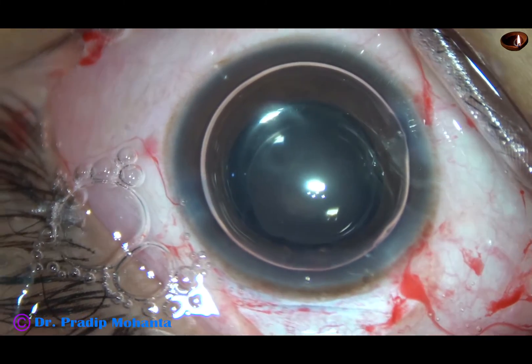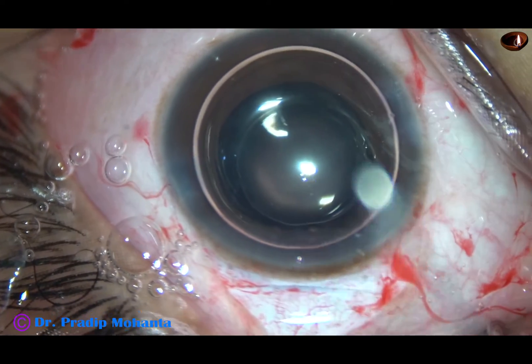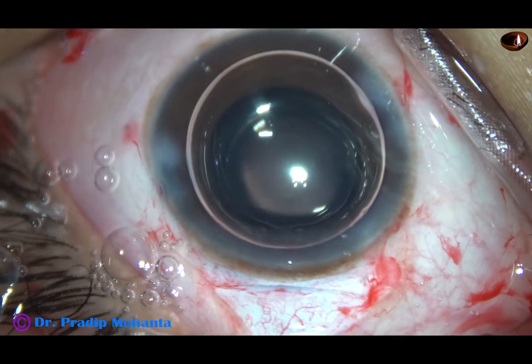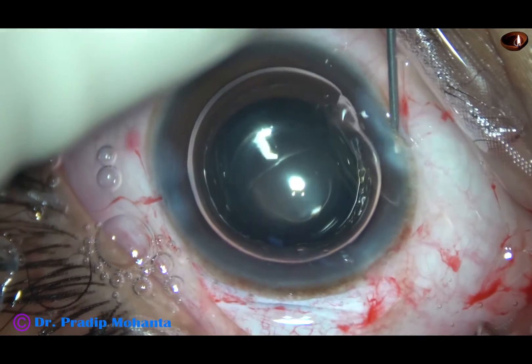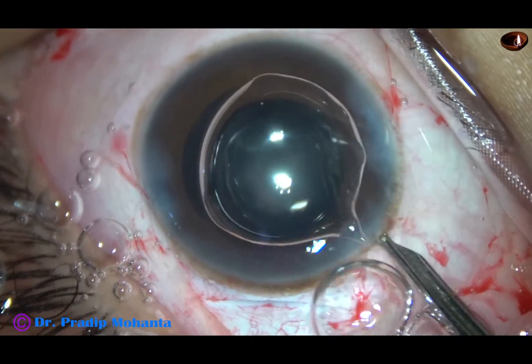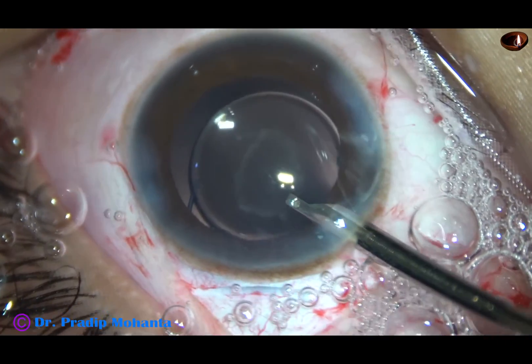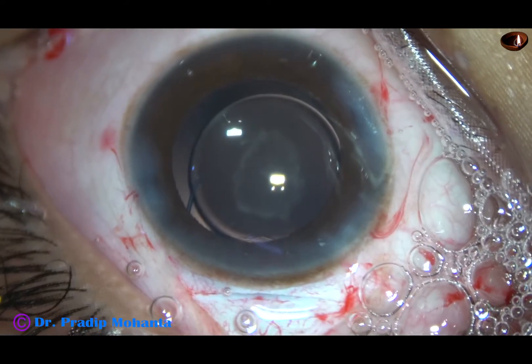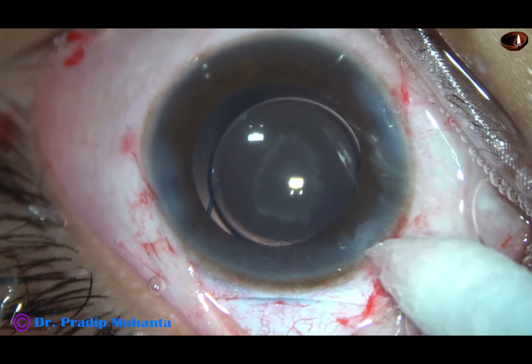To maintain the anterior chamber, I inject an air bubble. Here goes the moxifloxacin. And now I hydrate the corneal stroma on either side of the side ports for closure of these stab incisions. This is the final lavage. I find that the intraocular pressure is okay and there is no leakage from any side.